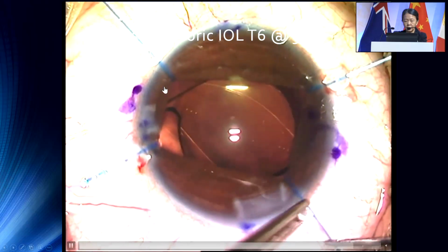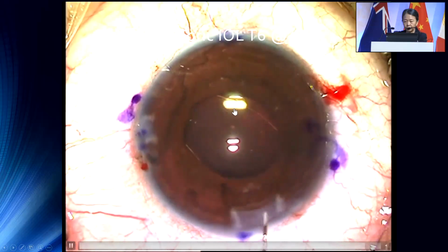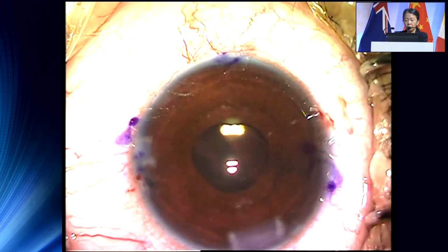And just here, there's really no capsule. All right, the rhexis has run out there. So once I put the haptic in, I've locked the optic into position. This lens is not going to go anywhere. So in this case, we managed to get away using the posterior capsule.